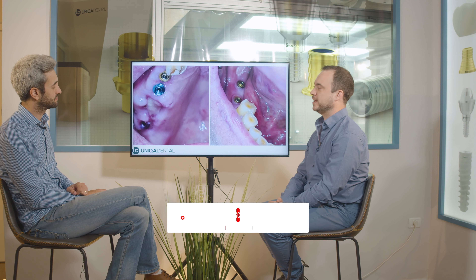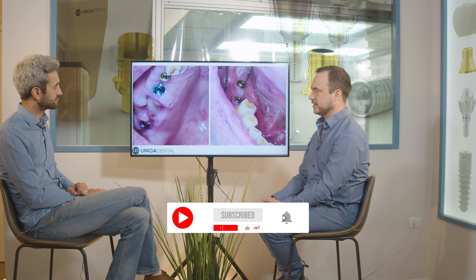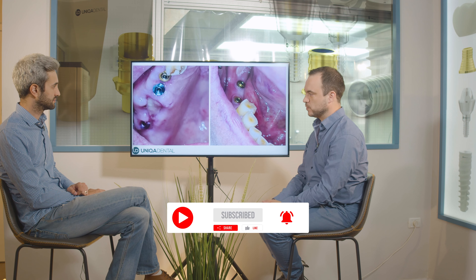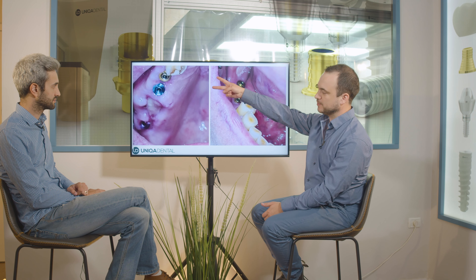Today we have a case where originally on the upper jaw we had three implants that weren't connected — we had a bridge with two implants and another implant with a single crown.